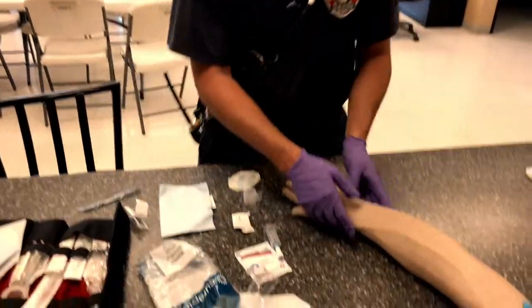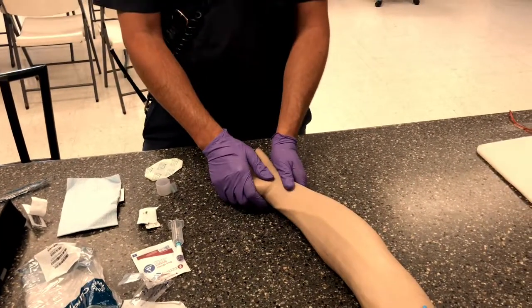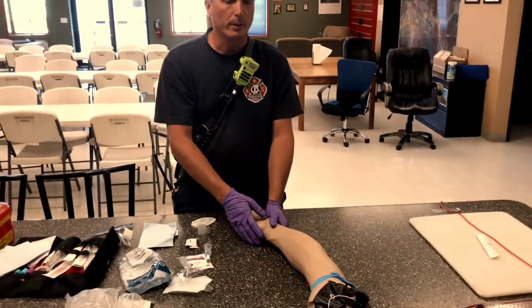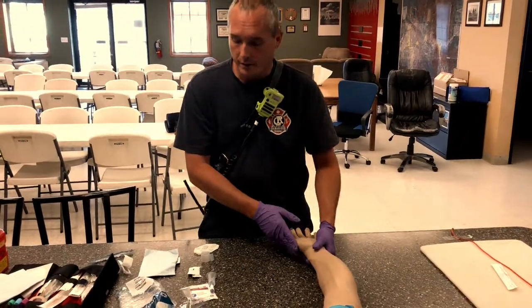All right, come back to the arm. We look down the arm, we got a nice fill set. We want to start low in anticipation. Very, very important skill is to move the patient to make the IV successful as much as possible. I know sometimes we're in tight spots and that's not an option, but the more we can move the patient to make it easier for the provider to start the IV, the better.